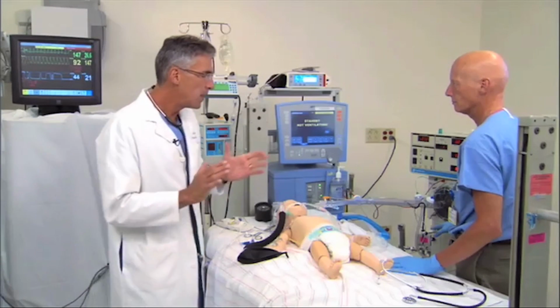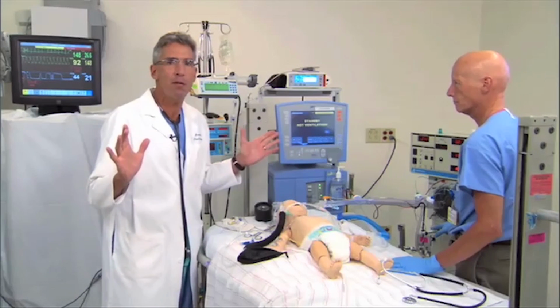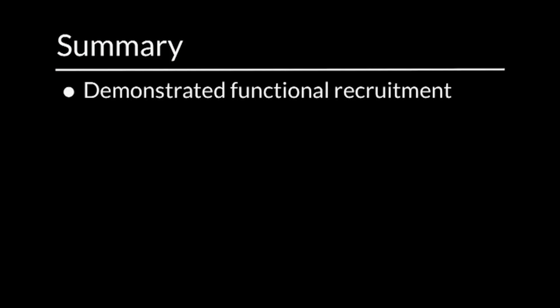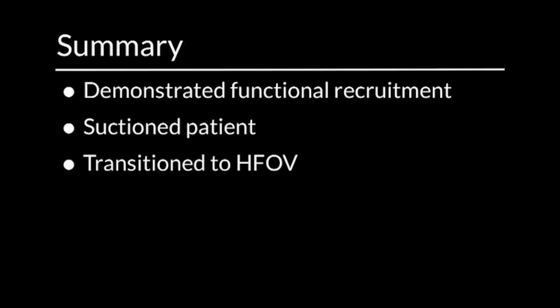Saturation is holding. Now, in the course of 5 or 10 minutes at the bedside, we have first demonstrated that there is functional recruitment by manually ventilating the patient. We've suctioned the patient. We've allowed her to recover from suctioning. Remember, suctioning does cause de-recruitment. We've then transitioned to high frequency. We weren't happy with our initial settings.